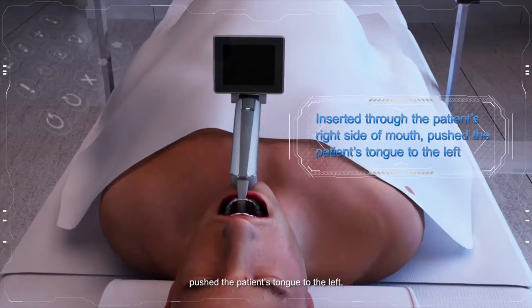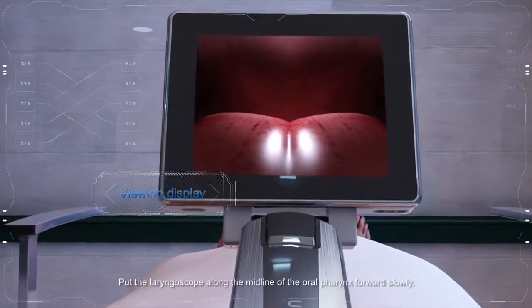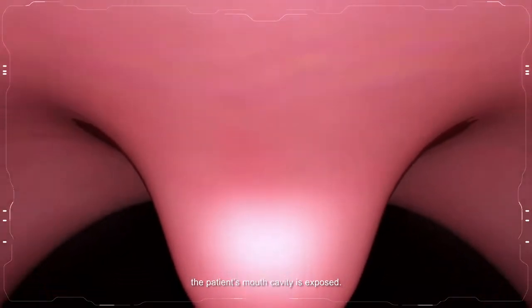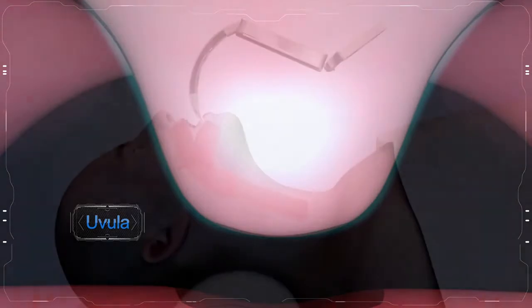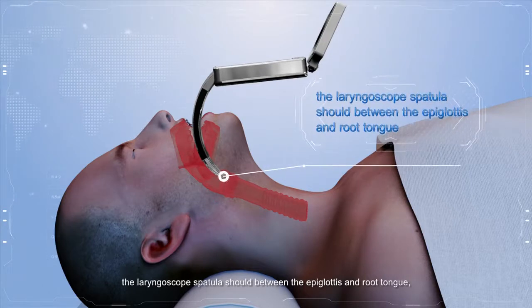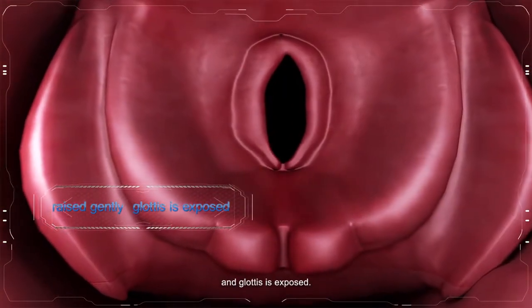Push the patient's tongue to the left and observe the monitor while inserting. Put the laryngoscope along the midline of the oral pharynx forward slowly. The patient's mouth cavity is exposed. After the uvula, the laryngoscope spatula should be positioned between the epiglottis and the root of the tongue. Then raise gently and the glottis is exposed.